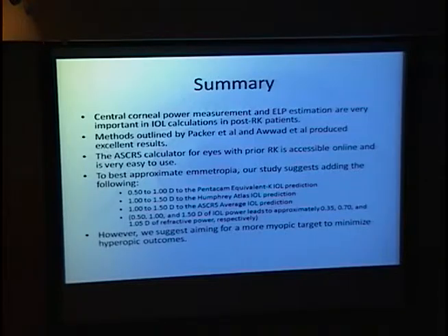So in summary, central corneal power measurements and ELP estimation are very important in IOL calculations in post-RK patients. The methods outlined by Packer and Awad produced excellent results, as I mentioned. But the one thing we like about the ASCRS calculator is that it's accessible online. It's very simple to use.